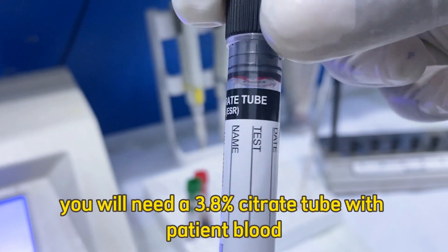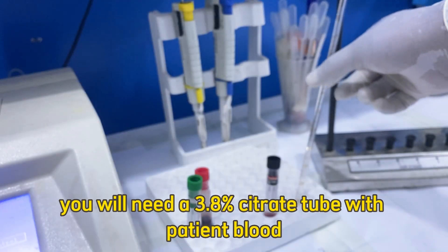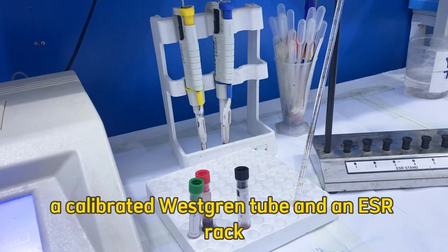You will need a 3.8% citrate tube with patient blood, a calibrated Westergren tube, and an ESR rack.